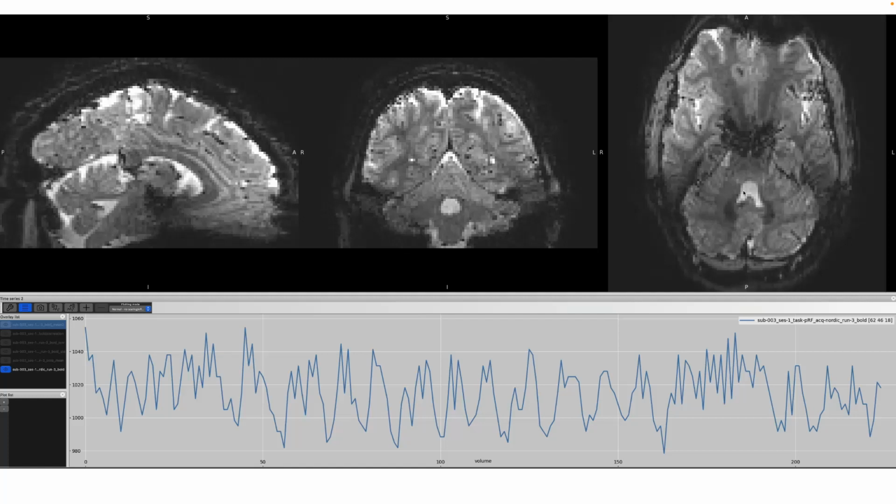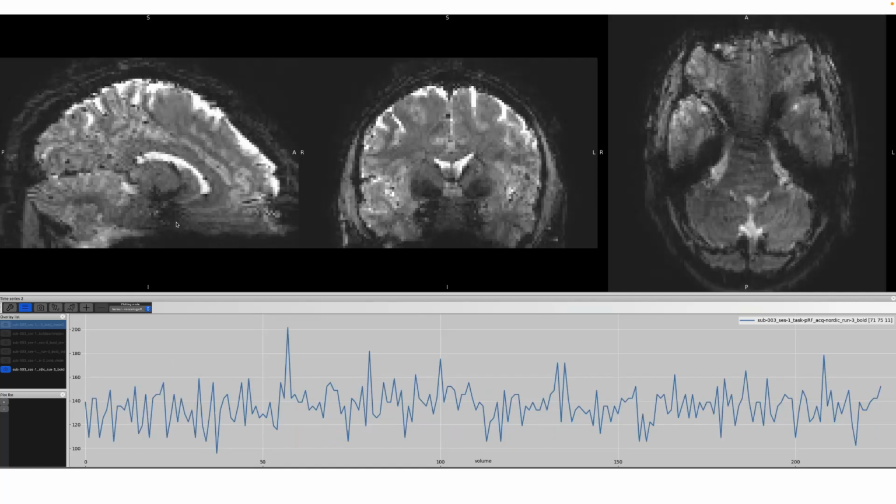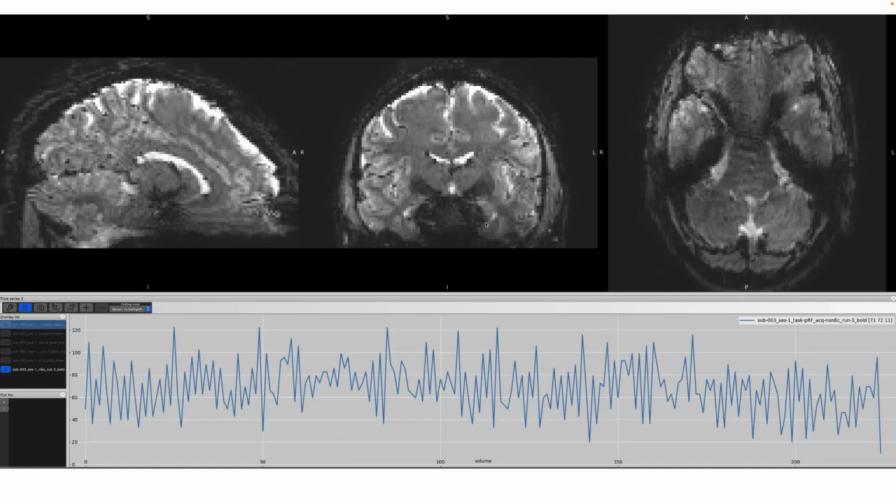So just to show you again, me zooming through my own brain here, veins, for example, this part, huge vein, very dark. You see that? So you can imagine that if that value was already low and you divide by that mean image, it's very easy to get huge fluctuations. Yeah? So just to highlight a few veins, here's a vein, those are veins, and I'm going to zoom through, see veins here, that's a vein, all veins, right?